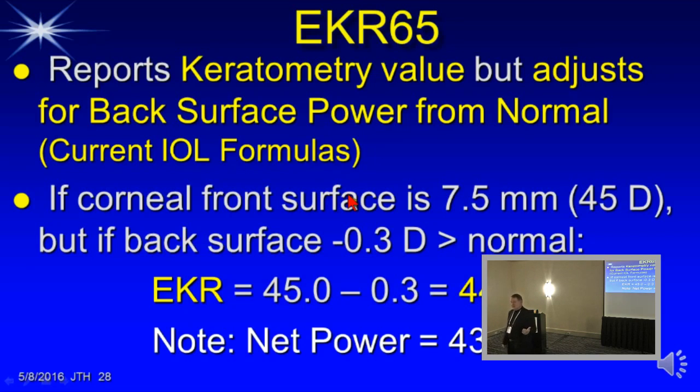Okay, now it turns out there's some other factors. So most of the studies show that if you look at the refraction post-op, it's about a half a diopter difference. In other words, about a half a diopter of against the rule is what you should add to your K readings to come out with a spherical refraction. Okay, half a diopter. Now what that means is IOL step sizes are about 0.75. So at the cornea plane, they're less than that. They're about 0.5, 0.55.